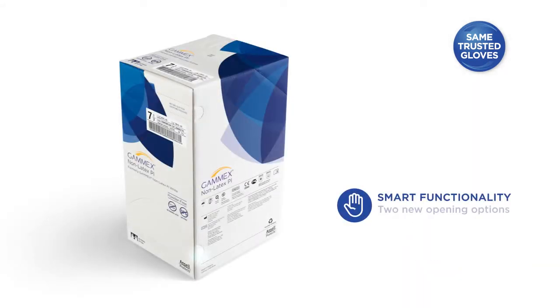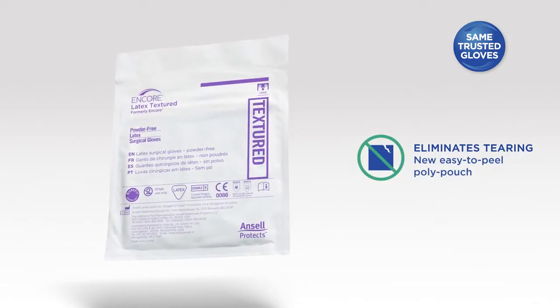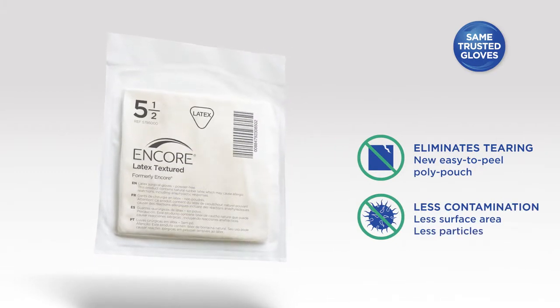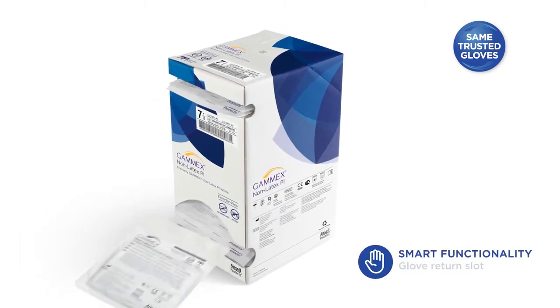Our new dispenser box opens from the bottom with an easy pull-open tab. Our sturdy new poly pouches resist tears, punctures, and abrasions even through rush donnings. They are impermeable to water and moisture. If you have taken out too many, you can return unused gloves through the top opening.